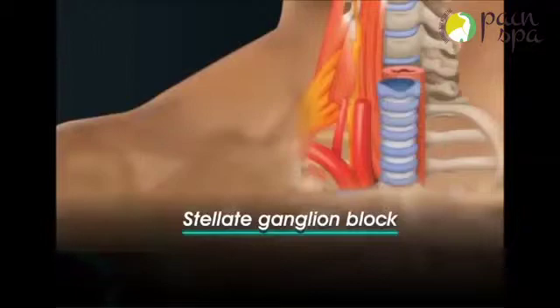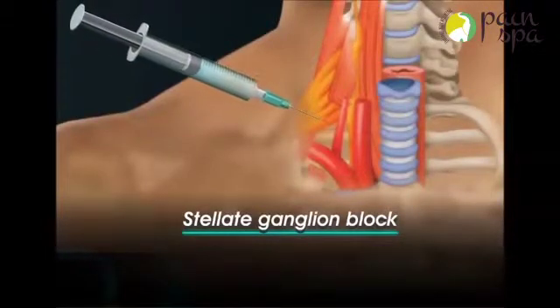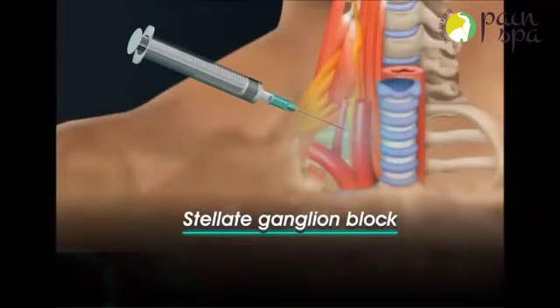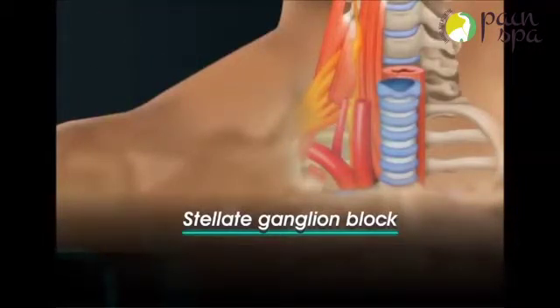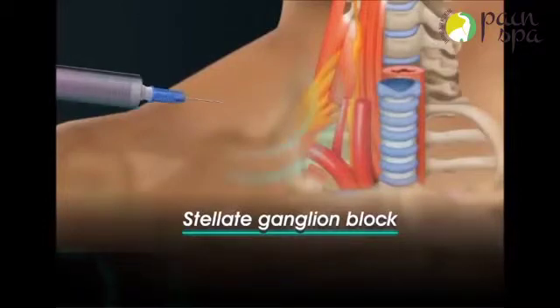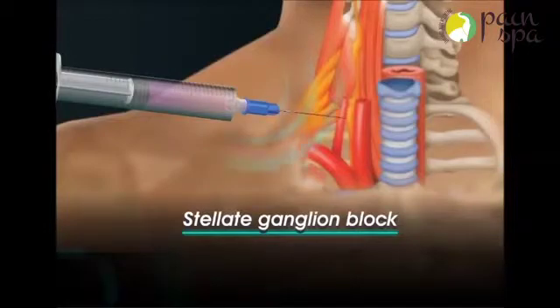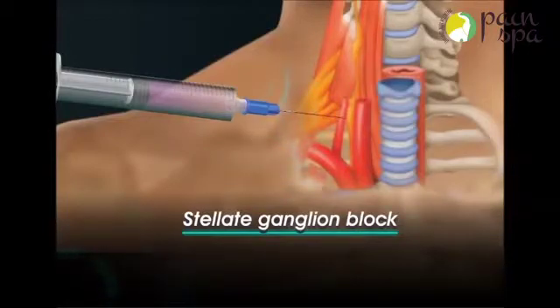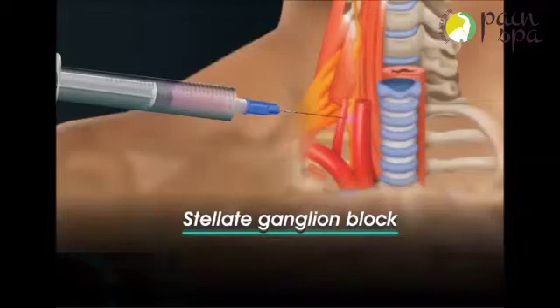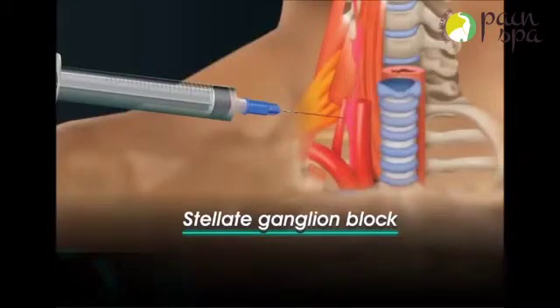The stellate ganglion block is performed under local anaesthetic. Dr. Krishna will initially numb the skin with a numbing medicine. He will then use an ultrasound machine to guide the needle close to the stellate ganglion, and finally inject a small amount of local anaesthetic around the nerves.